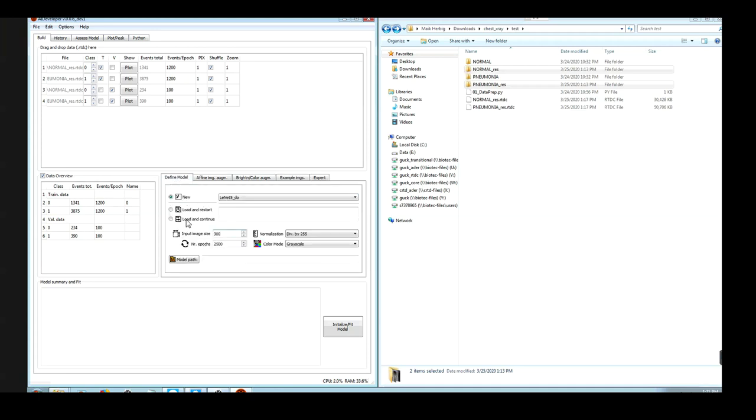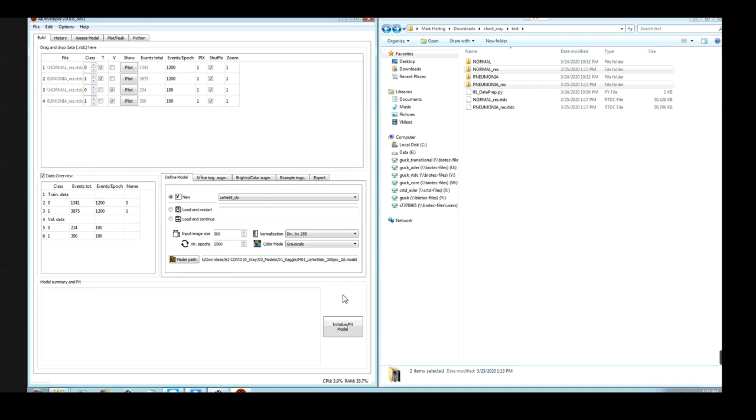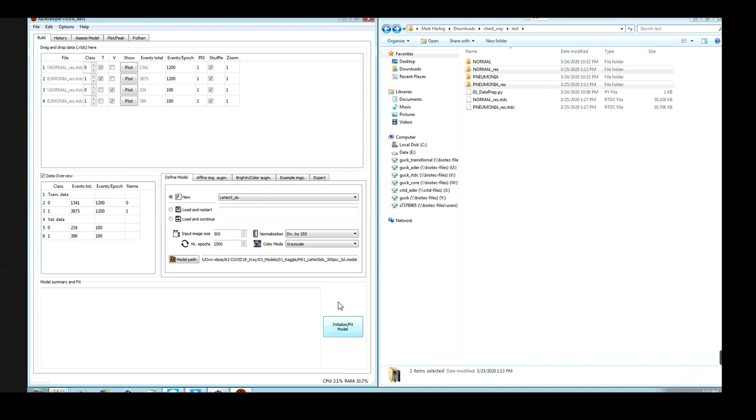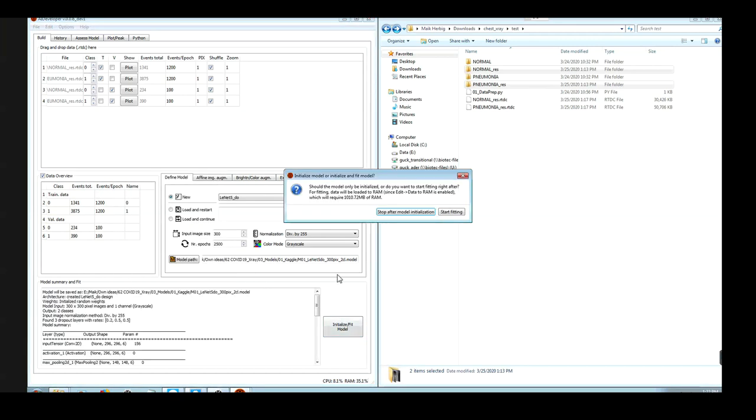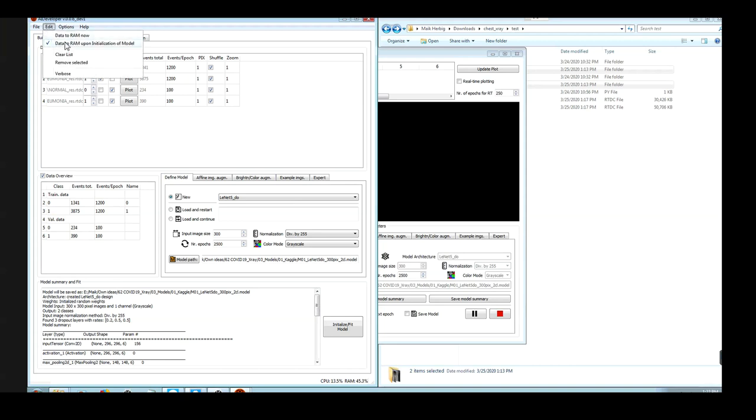Now we only have to define the path for the model we want to save and define a name for our model. So this is model number one. We will fit a LENET 5 with dropout. The model will accept image sizes of 300 by 300 pixels, and the model has two classes. Now we can initialize. And it tells me that the dataset will require 1000 megabytes of RAM. I have that amount of RAM available, so I can just go ahead and start the fitting process. Otherwise I would need to uncheck this option.